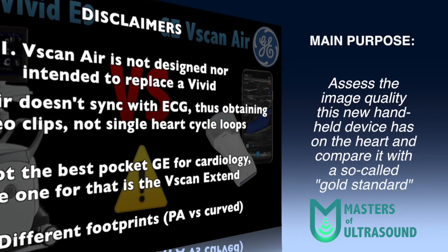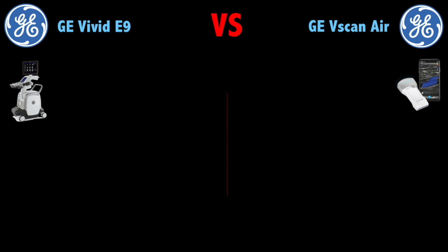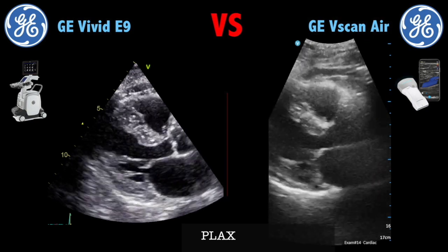The purpose of this comparison is to get an insight of the image quality of the device in a real-life setting, not just the promotional images. Now let's start with the first patient, which is a normal study.